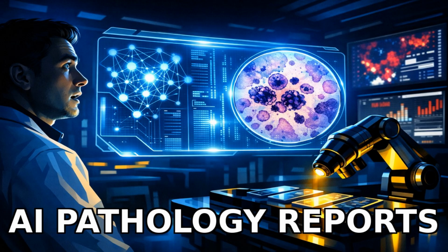Today, we unpack a bold pilot that tests two general-purpose multimodal AI systems, OpenAI's ChatGPT 5.0 in agentic mode, and H Company's Surfer, as they explore whole slide images on a web viewer and try to describe tissue features and propose diagnoses. The setup is simple but wild: 35 veterinary cases, a slide viewer, and a pair of board-certified pathologists who validate every output. The goal isn't to replace experts, it's to see how far autonomous perception, planning, and tool use can go in a real diagnostic workflow.